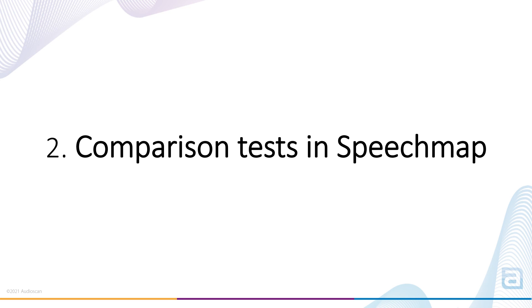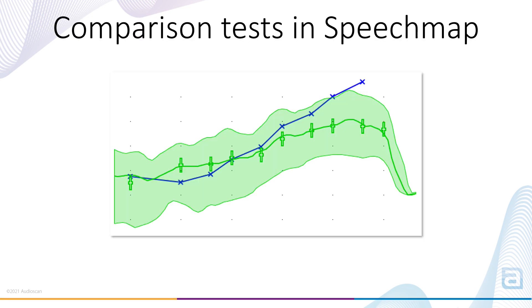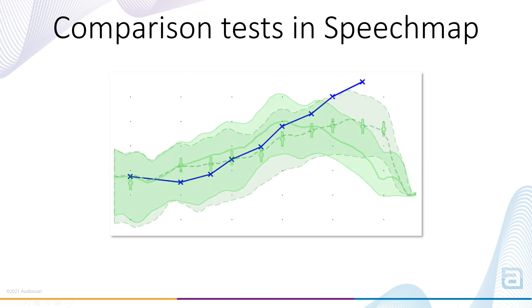Comparison tests in speech map. Comparison tests allow you to set a previously measured curve in speech map as a comparison test. A second test can then be performed in the same test slot and visually compared with the previous measurement. This capability can be particularly useful when, for example, a client is changing hearing aids and you'd like to program the new devices with an output identical to a previous set.